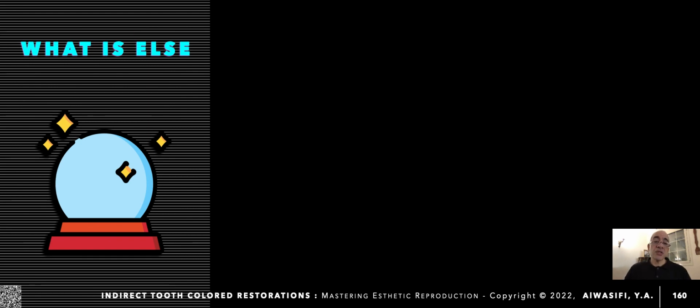Then comes the question, what else? When you imagine the improvements of using artificial intelligence in digital dentistry, now we are constructing restorations by subtracting a bulk from our block, and this ensures that there will be a loss and waste of material because you start with a great bulk which is carved and subtracted to the shape required for your work piece.